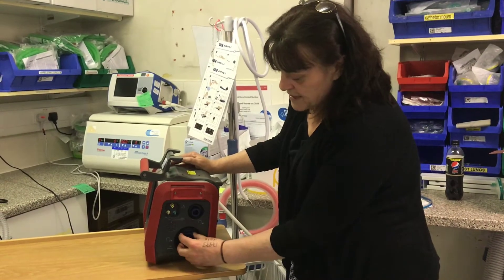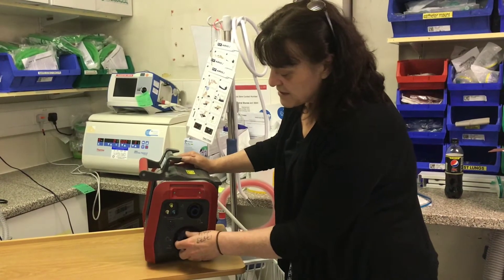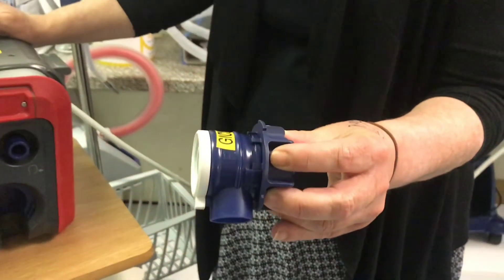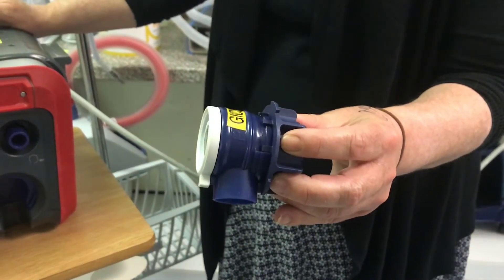If I take the valve and then click to the left, that releases the valve, then I can pull out. This is the valve, which will then go to the container for the technicians to take to CSSD for cleaning. They will collect it and put it back together again.